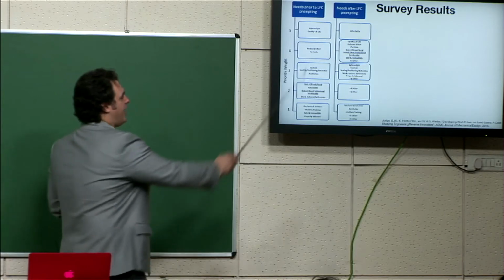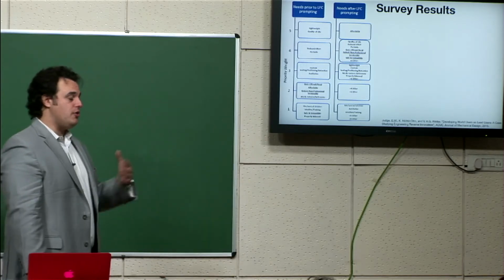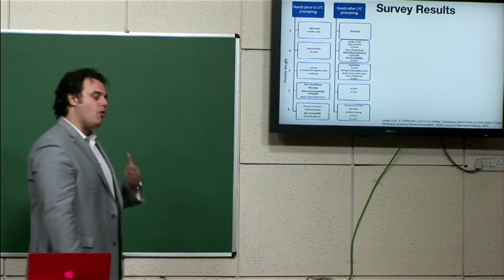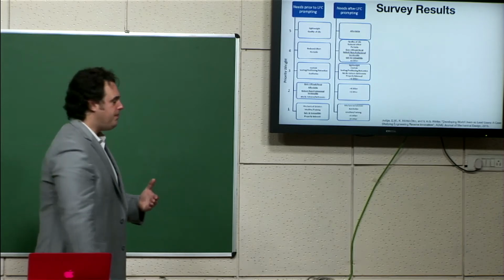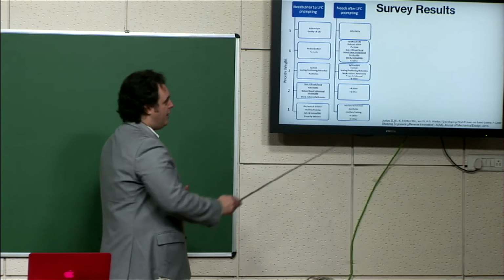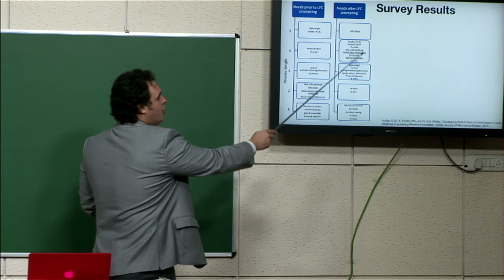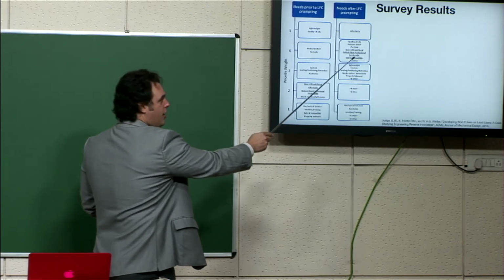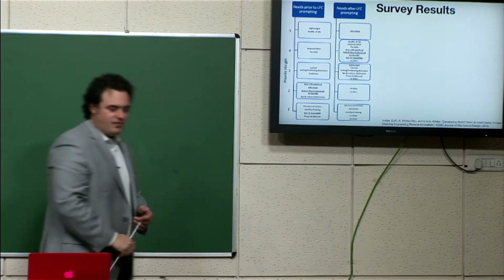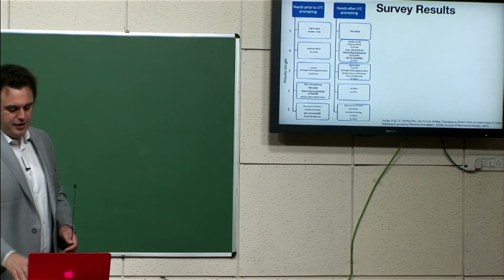And that's how they rated these factors. Then what we did is we showed them the LFC. We showed them videos, we explained what they did, and asked them again to report what are the features that are important to you. What was interesting that came out of this is that some of the merits of the LFC became higher weight priorities, like affordability, goes off-road, is serviceable by a non-professional like a bicycle mechanic, etc. And so it started cluing us in that yes, there is value in the LFC's features.